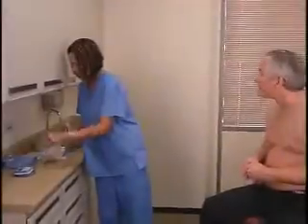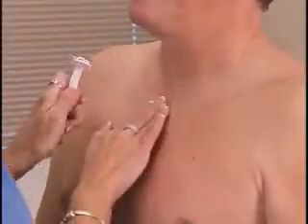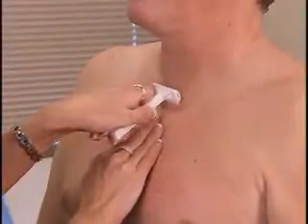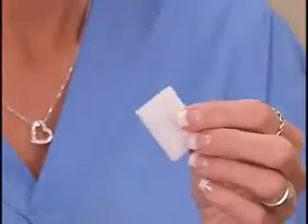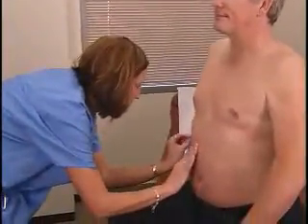The following instructions should be used when preparing a patient for a Holter test. Always shave the electrode sites if there is any body hair present. Next, take the abrasive pad from the prep kit and exfoliate the skin of each electrode site until the skin appears abraded and dry. Cleanse the electrode sites with the included alcohol pads. Before applying the electrodes, make sure that the prepped area is completely dry.